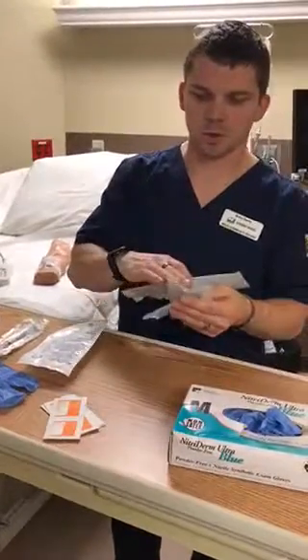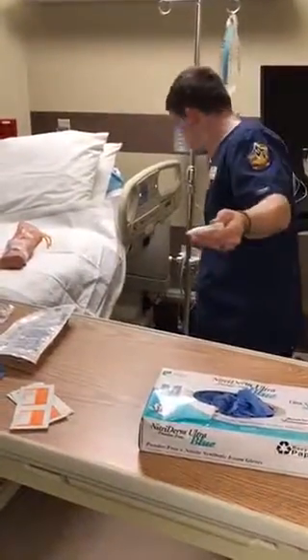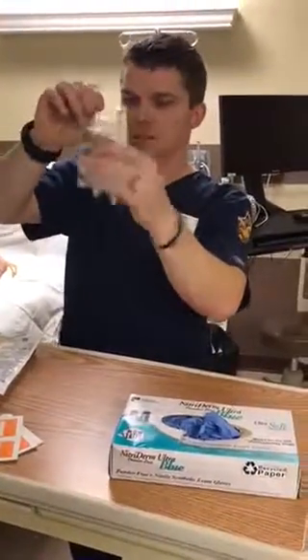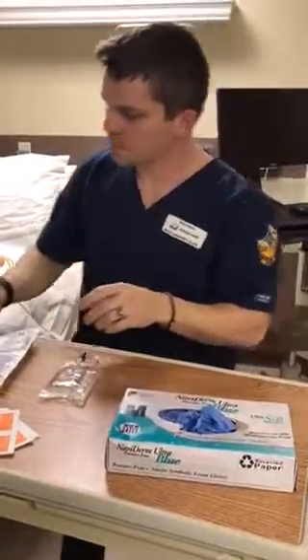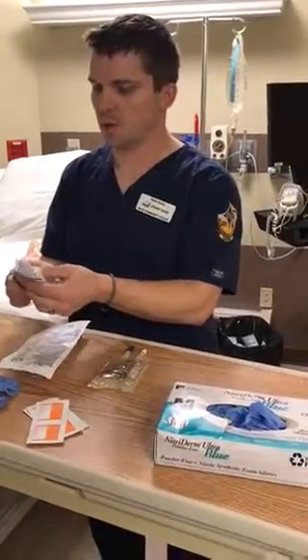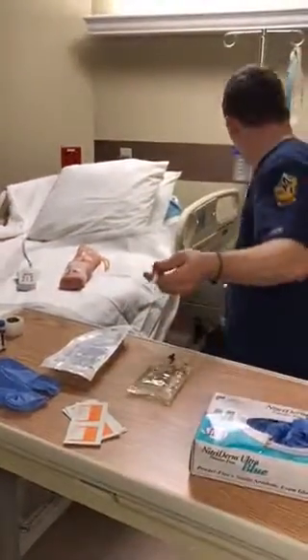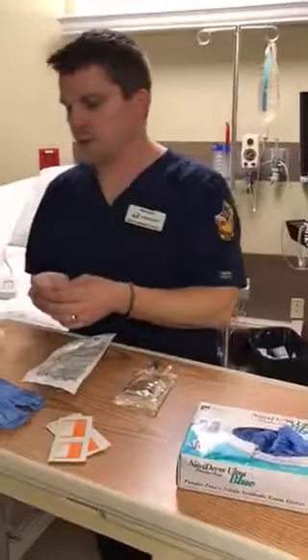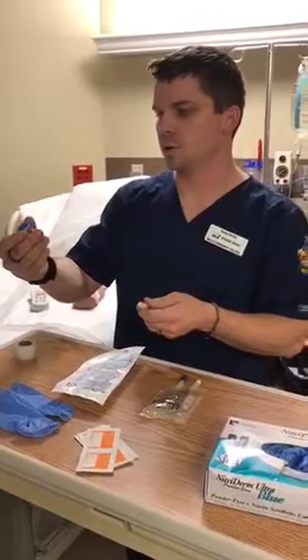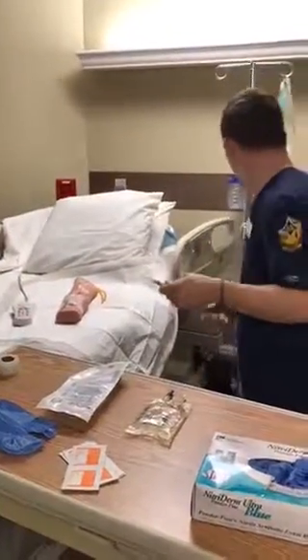I'm going to check my solution, which is in date, July of 18. I'm going to go ahead and throw that over here. And I'm going to make sure that it's a clear solution and that there's no floating particulates or anything like that. And I'm going to select a 3 milliliter syringe. Since Bob O has 30 milligrams of Practivile ordered, I'm going to use a 3 milliliter syringe to draw 3 milliliters of the solution, which is 10 milligrams per milliliter.